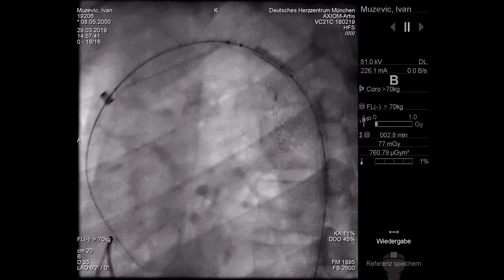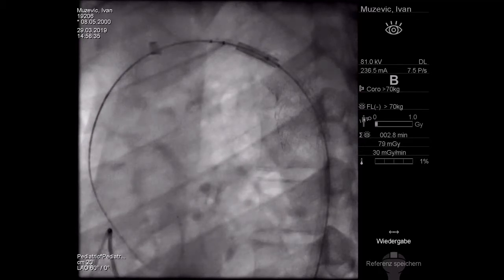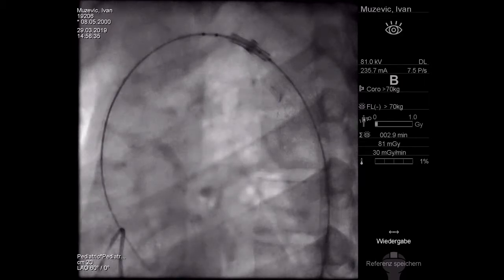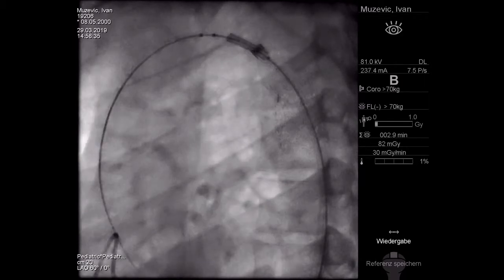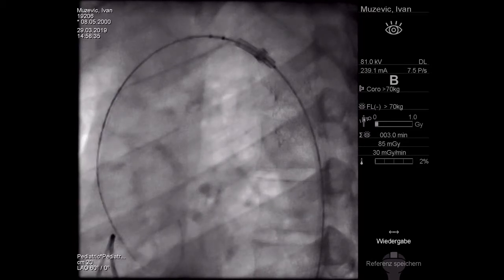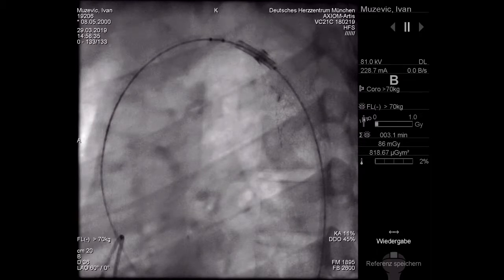And we do not intend to use the bib as a bib. We use this only because we have the bib balloon in 16 millimeters, and the shortest 16 millimeter balloon we had is a 3 centimeter balloon, and this is a 3 centimeter long bib balloon. So I go now to push back the long sheath, and still half of the stent is free, like this. And now I think I go a little bit back because the rib, which you see there on the distal part of the stent, is a good landmark for the target region.